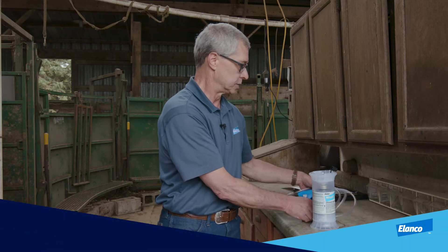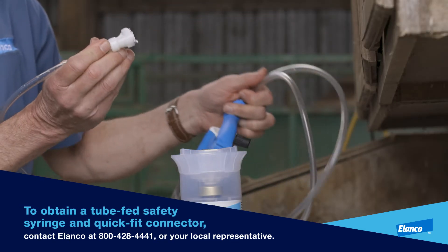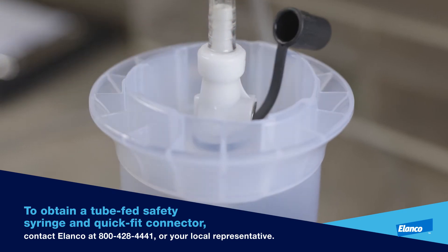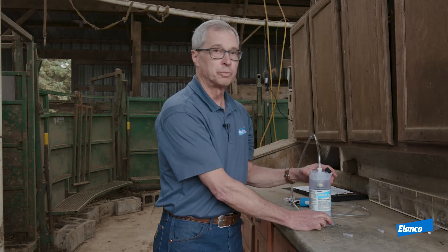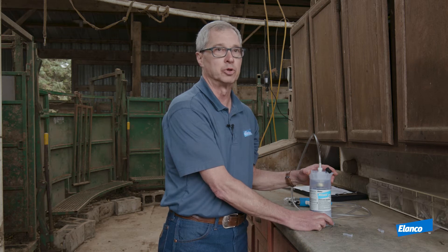Then we're going to take the safety syringe and the tubing — this has a quick coupler — and push down quickly. You should have heard it snap into place. At this point we're ready to take the shroud and the syringe over to the animal, where I will invert the shroud and start to fill the tube and the syringe.